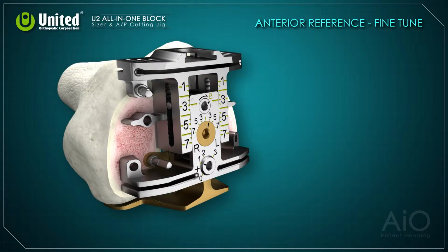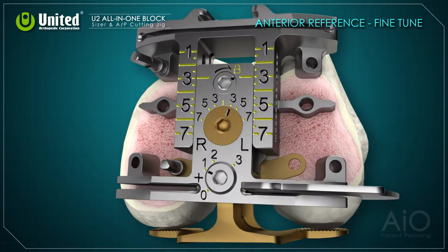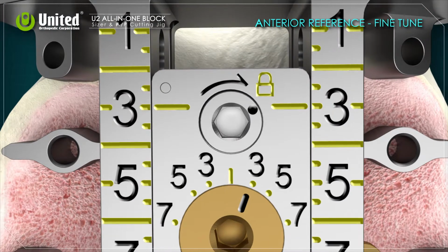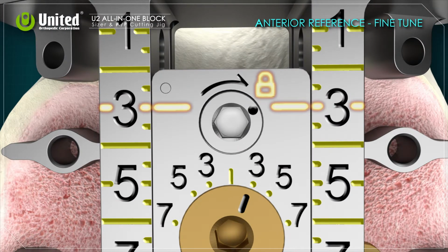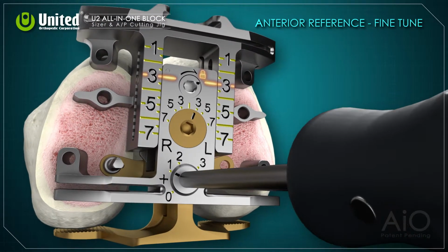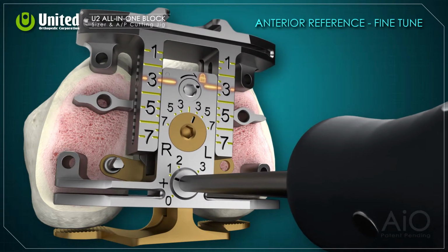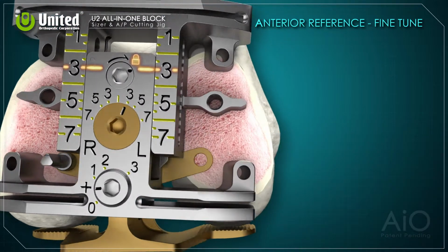Before the AP cutting, we recommend using the lower point gauge to estimate the cutting volume. In some cases, the posterior cutting is too much and the surgeon will decide to adjust the cutting level slightly. At this time, keep the AP distance locked, loosen the threaded pin that fixes the anterior slot, and adjust the AP cutting level by rotating the bottom knob with the screwdriver to raise or lower the cutting slots.